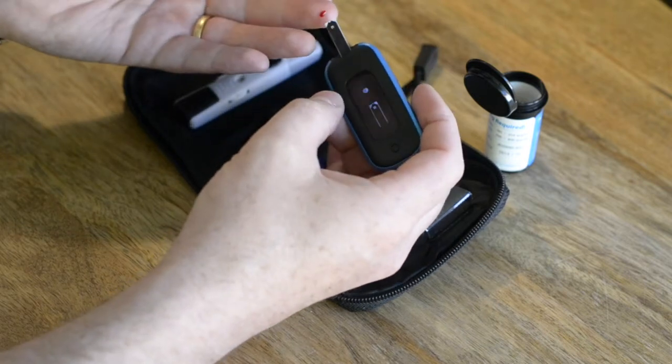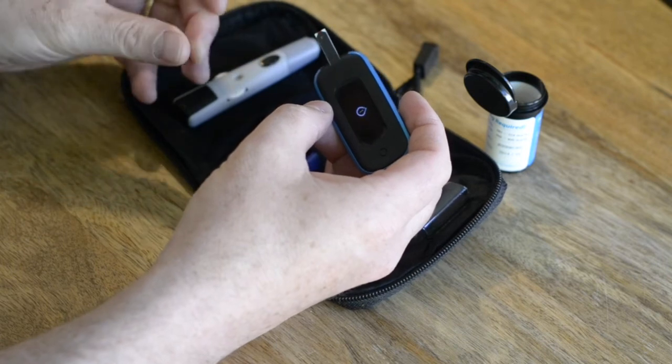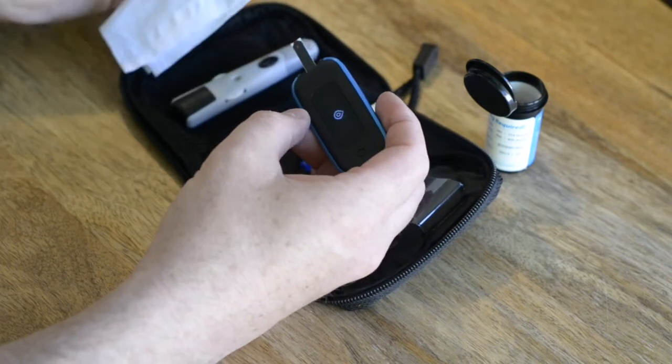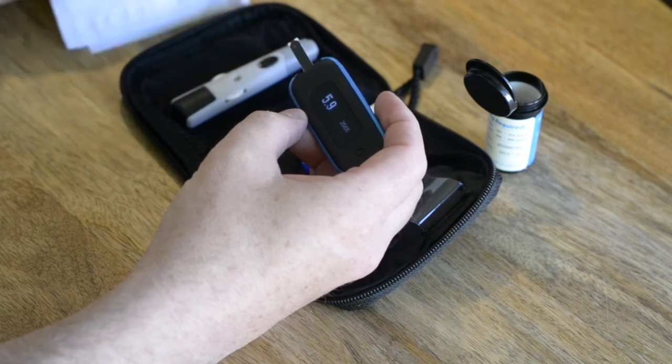Next, place the droplet on the end of the test strip as shown. After a short while, the device will beep to say that the sample has been successful. After a few seconds, you'll see the result of your blood sample on the AgaMatrix screen.